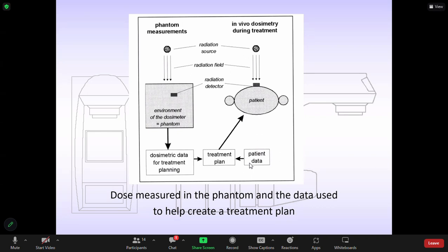And those devices are sensitive to radiation. So it's very common to do in vivo dosimetry for those people. In fact, every time there is a patient with a pacemaker, we measure the dose the first day of treatment.